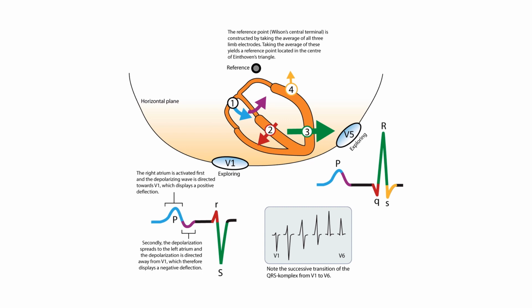And what you might see, and I cannot always figure this out in my head, I think it's really hard, but I know some of my colleagues, some cardiologists, but not all, who can do this in their head and say, oh, I know which lead is the problem because the voltage should go this way and this way. But this is the basic theory or hypothesis for this.